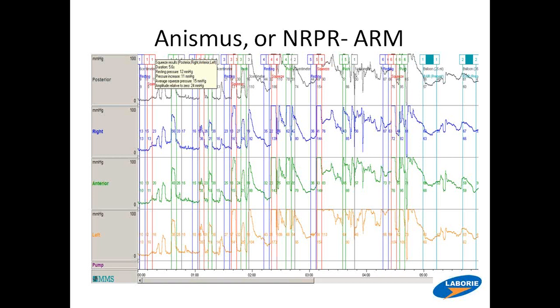History of pain in the buttock and inner thigh that was treated with chiropractic manipulation, but otherwise nothing that would draw you to have any conclusions up front. I thought his rest and squeeze were normal. But, and here's an example where the digital exam doesn't always correlate with these numbers. It certainly isn't 100%, but he had a twitch in his muscle. That's what he had.